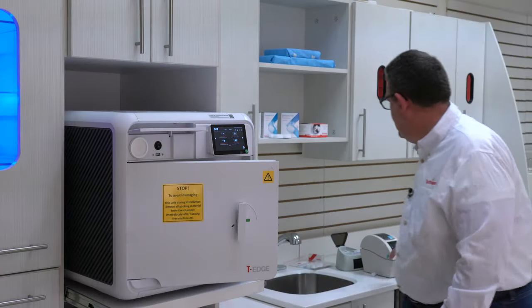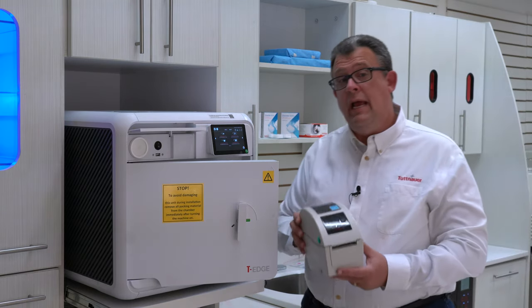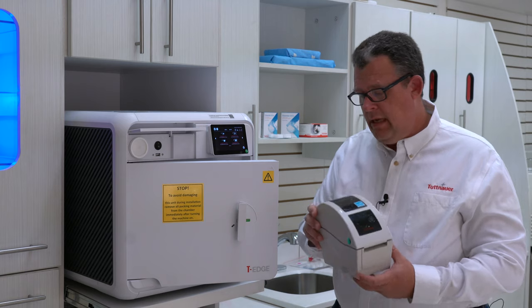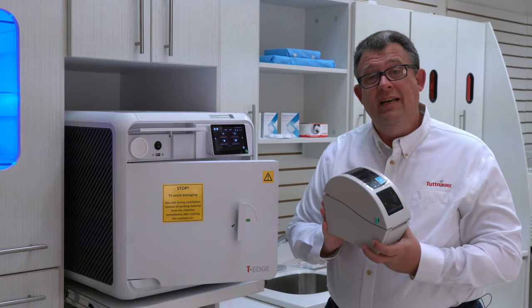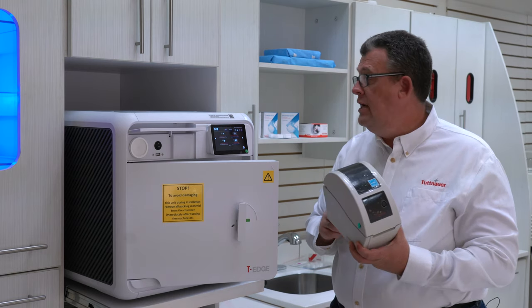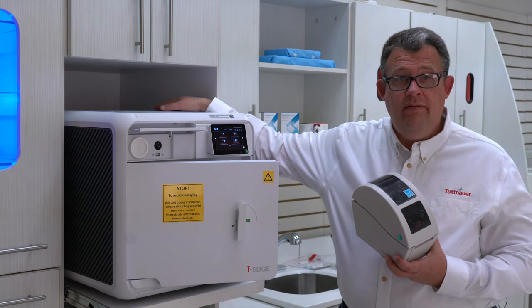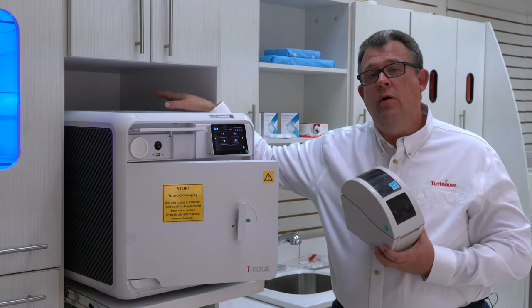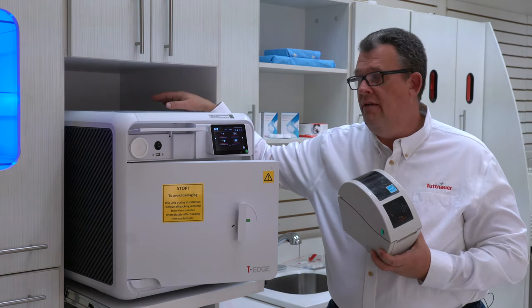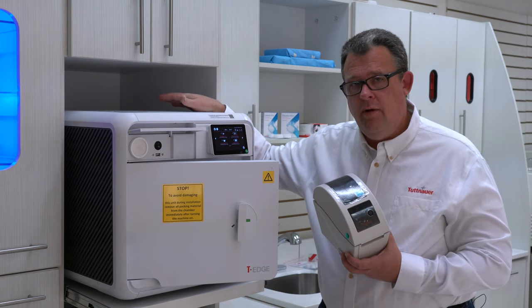The printer that we have for the T-Edge is both a printer and a label maker. It will come with a separate cord and a USB port. You're going to take that USB cord and plug it into the back of the autoclave. You're going to do that while the autoclave is completely off — both the front on-off switch as well as the rear on-off switch.